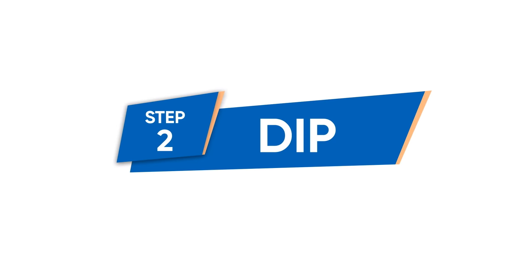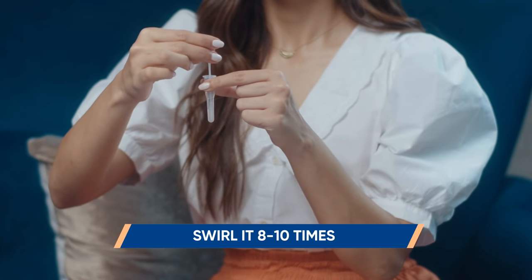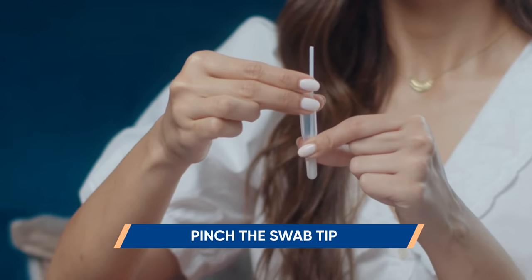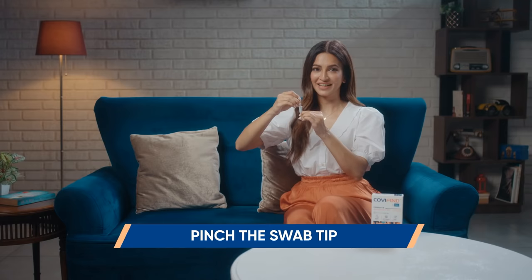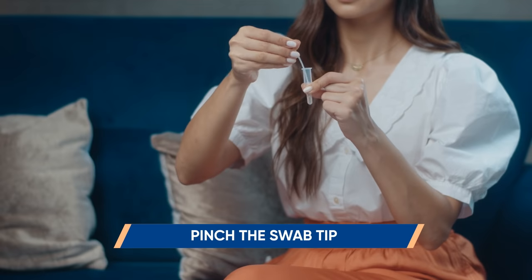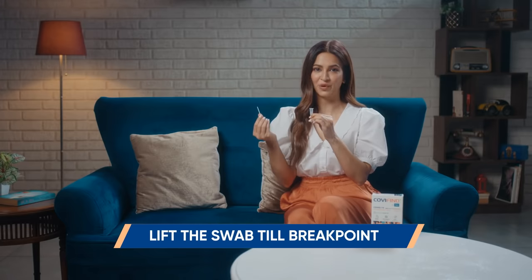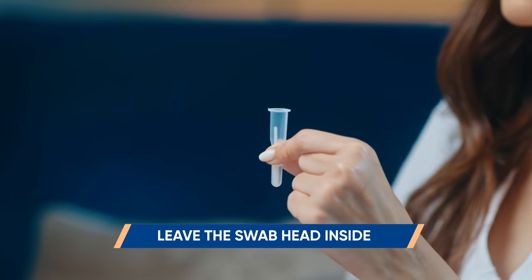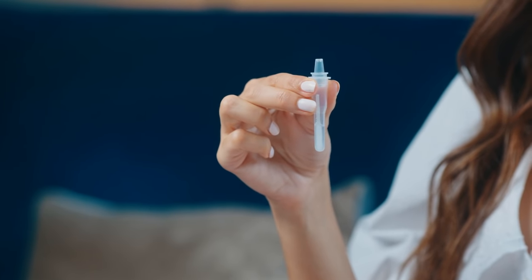Step 2: Dip. Insert the swab in the buffer tube and swirl it 8–10 times in the fluid. Pinch the swab tip through the tube and remove any remaining fluid. Hold the buffer tube firmly, lift the swab till break point and snap. Snap the handle at break point. Leave the swab head inside the tube and discard the stick. Now firmly secure the cap on top of the tube.